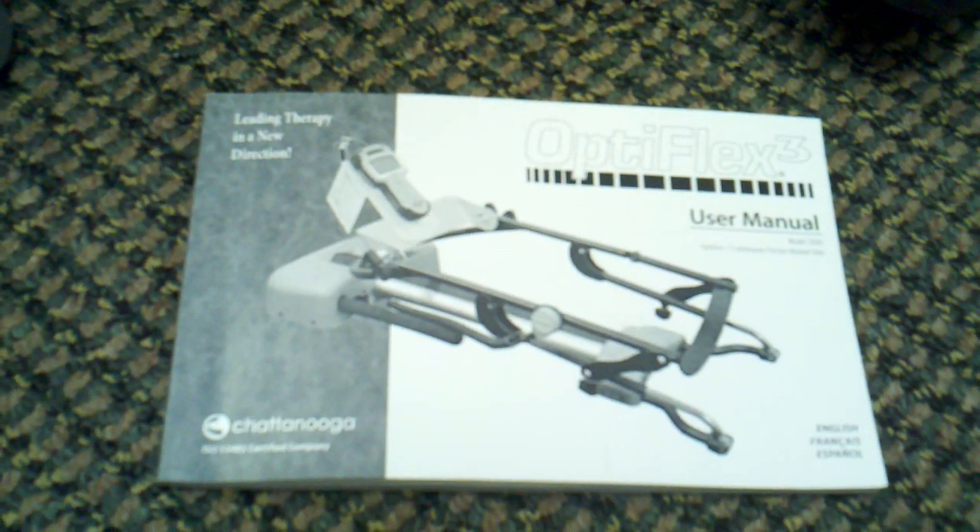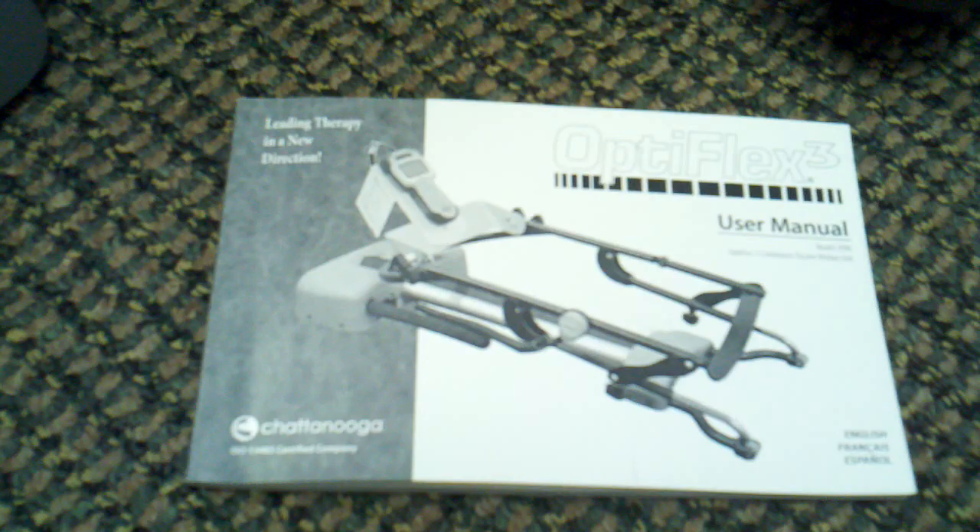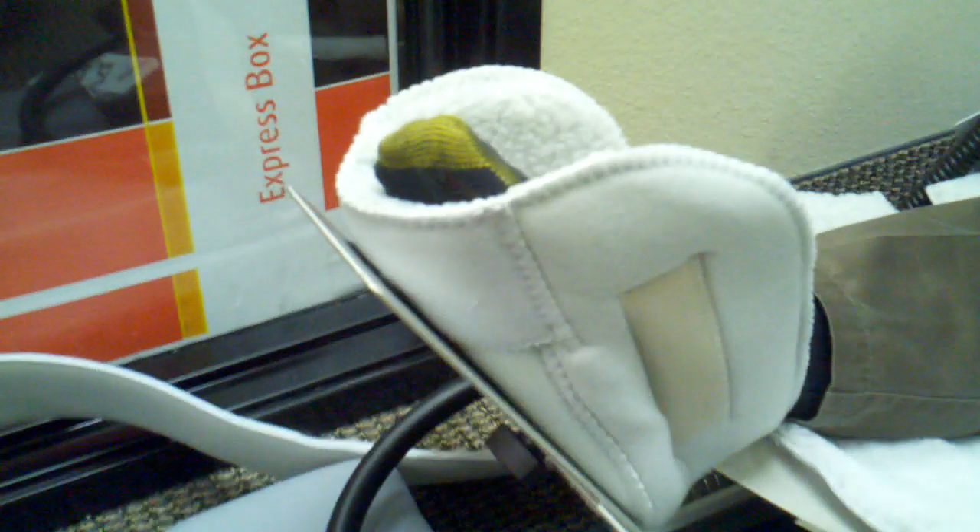Hi, you are looking at the Optiflex 3 by Chattanooga and we're going to show you today briefly how it works. We're going to have the gentleman here who is a therapist talk about it briefly.